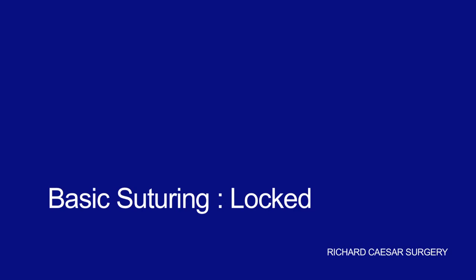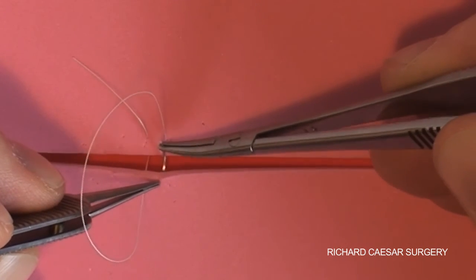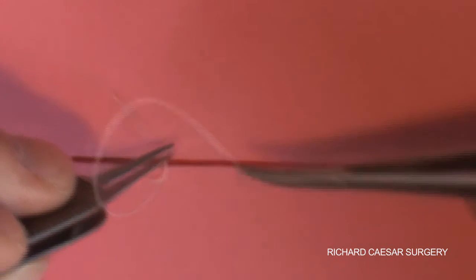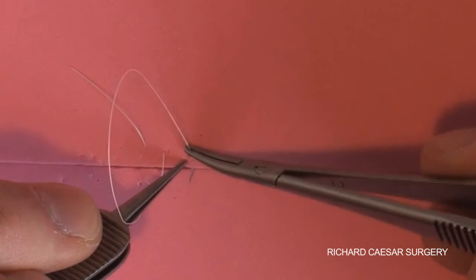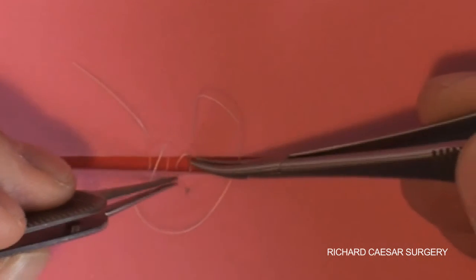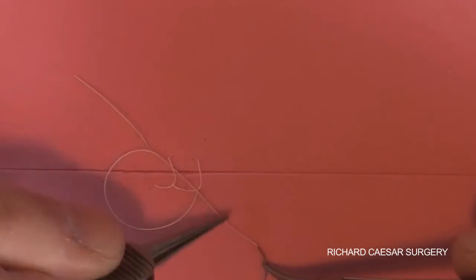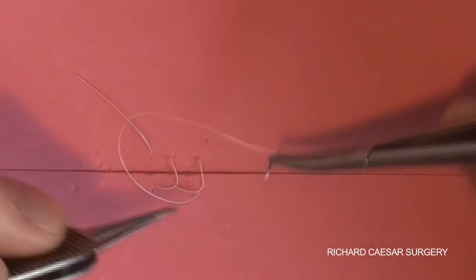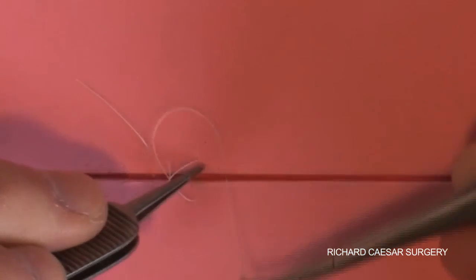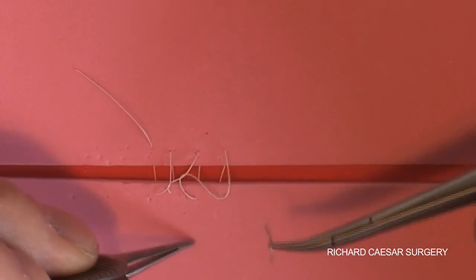Another technique worth practicing away from the patient is the locked suture. You might use this when closing skin in front of the ear, having borrowed some donor skin. You essentially place a running stitch, but you want each suture to lock. Pass the needle through both sides of the skin, pass the loop over the needle, and pull the needle back through such that it's immediately locked. Again, go through one side, through the other side, and once the needle's through, pass the loop over the tip of the needle, pick up the needle, and it's immediately locked.